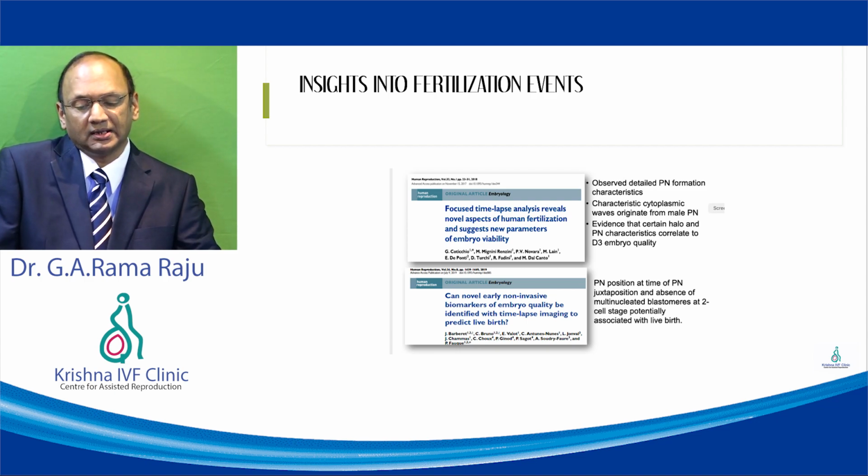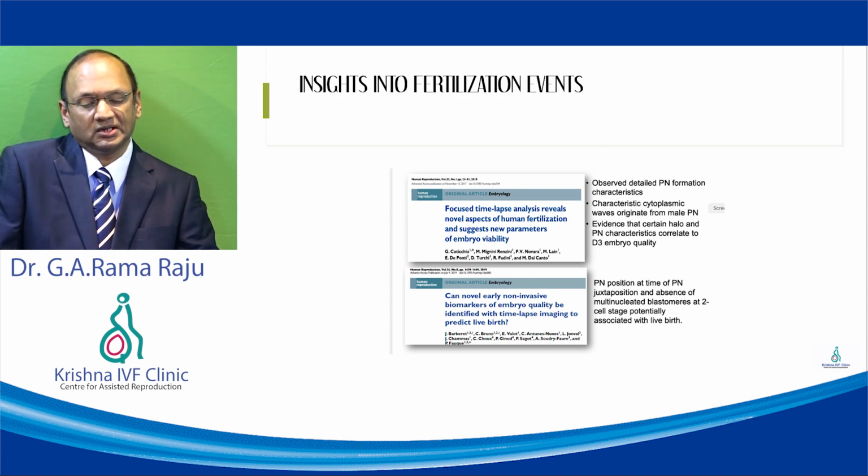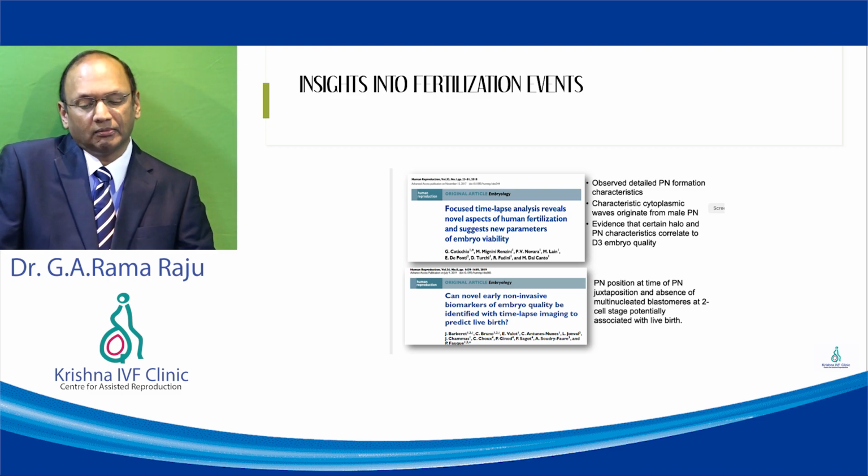embryo viability, in which pronuclear formation characteristics are assessed, the cytoplasmic waves are analyzed, and the evidence of the halo of the cytoplasm to predict the implantation potential. There is another paper which says a possible biomarker: non-invasive time-lapse technology might in future be a possible biomarker to identify embryos to predict live births.